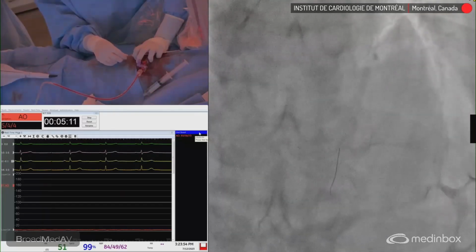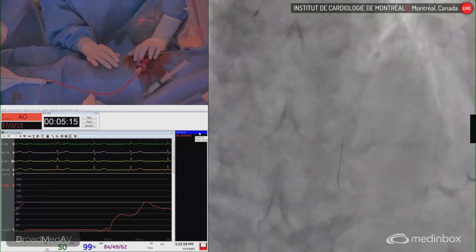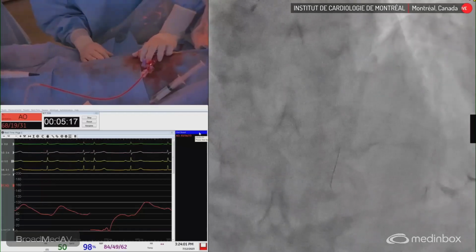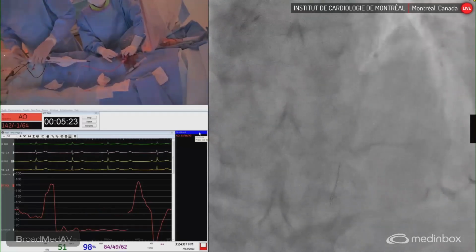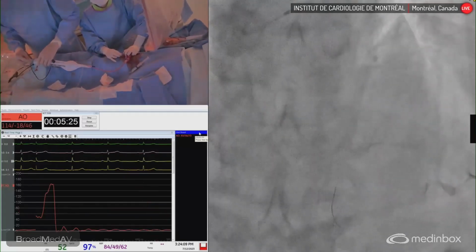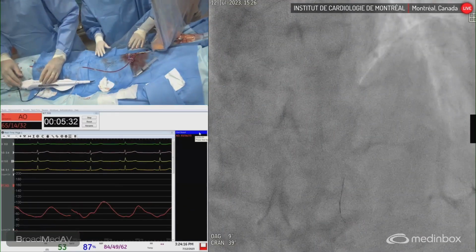Okay, hold on for a second. So now that we have pushed this a little bit, I'm going to just make it go ahead a little bit. Okay, advance. Okay, hold on. Okay, so I just set it a few times so that we don't have surprise. It doesn't jump.